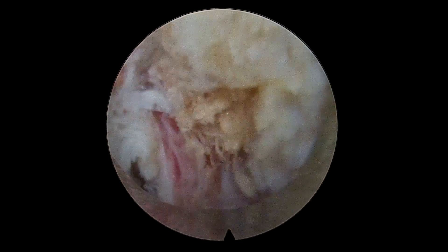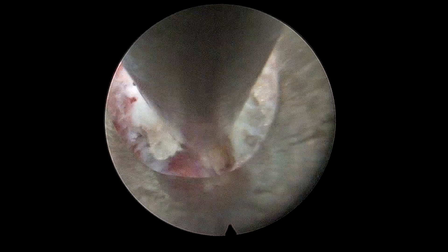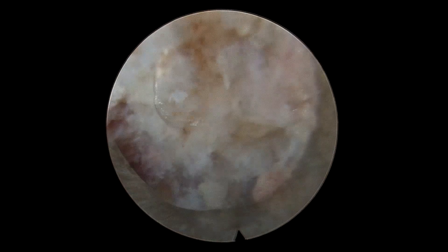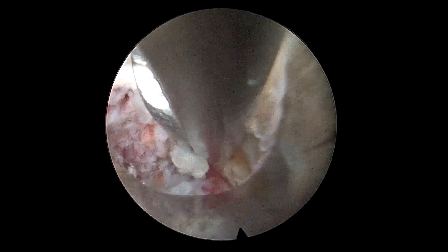We entered into the disc and decompressed further free fragments. Thereafter, we pursued the root towards the foramen to further decompress the bony compression and soft tissue hanging from the posterior part of the foramen.